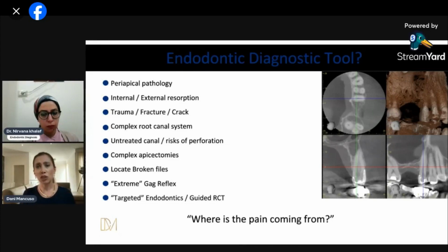And it's good because it's trust as well from the patient. You can discuss everything beforehand. You don't need to stress that anxious patient unnecessarily. So you take the CBCT, you can give all the indications of what to do and which kind of treatment you are planning.